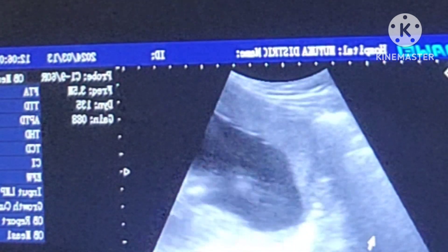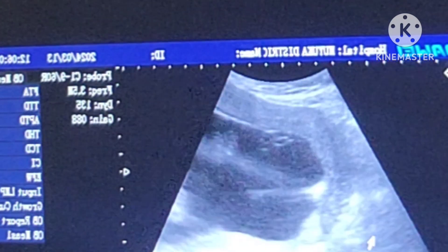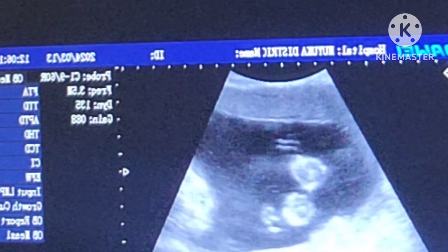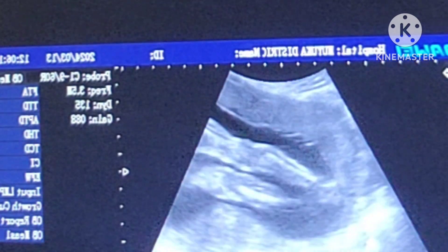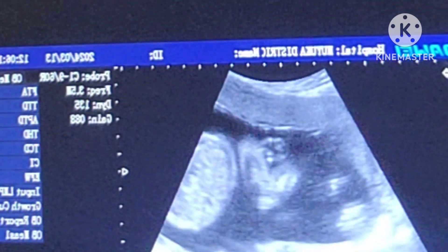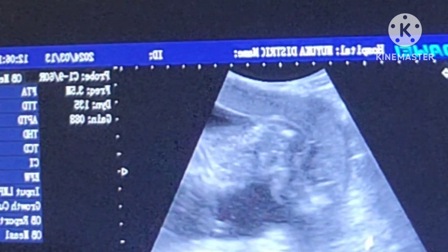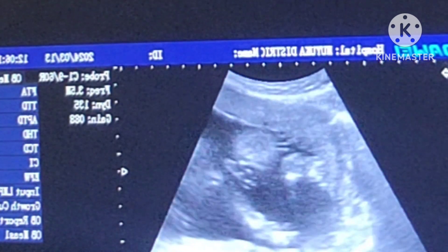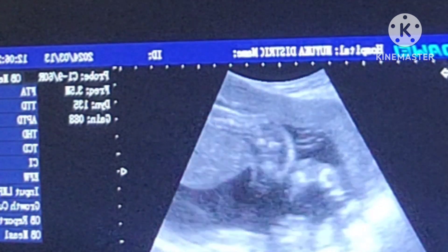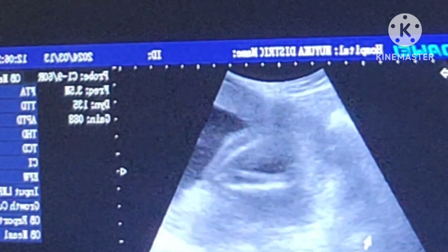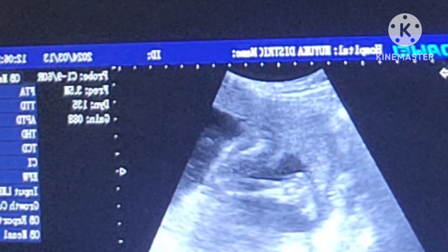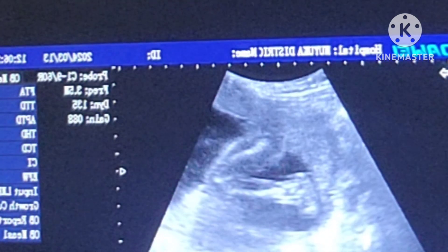Unlike your first trimester ultrasound when the fetus looked like a tiny cluster of cells, a routine prenatal ultrasound can check for defects or other problems in the fetus. The following can be examined: abdomen and stomach, arms, legs, and other structures. This is the type of image pregnant mothers may see on the ultrasound screen, or that the technician may print.